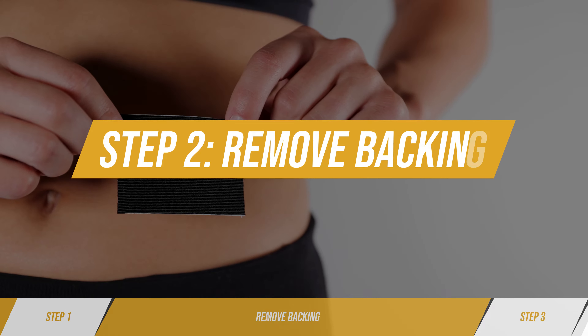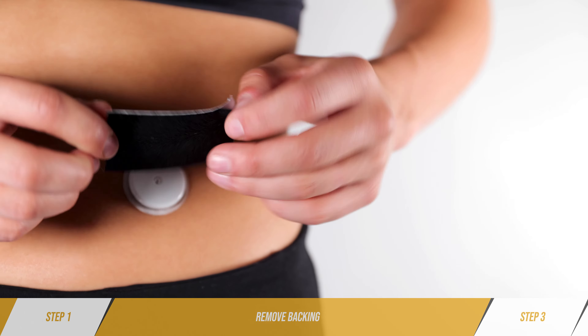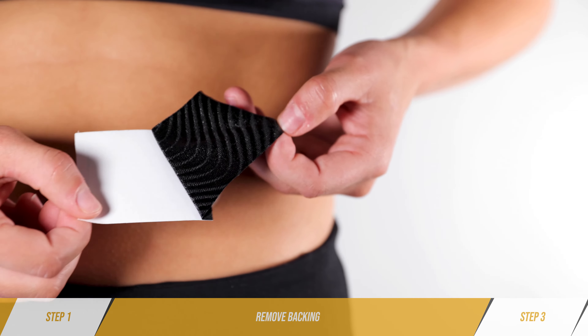Step two: remove backing. Remove the paper backing from the piece of tape.